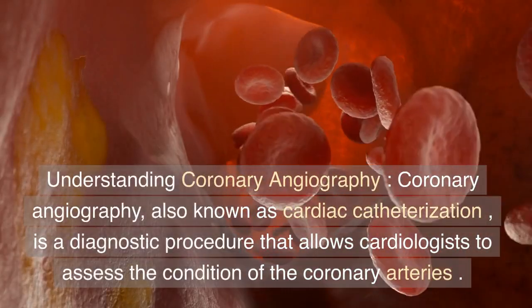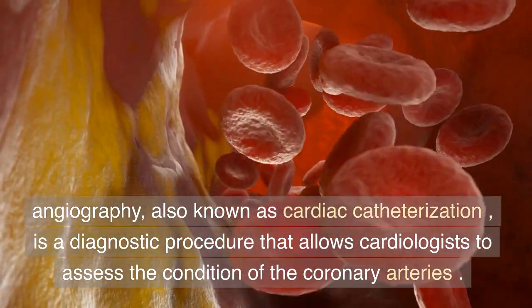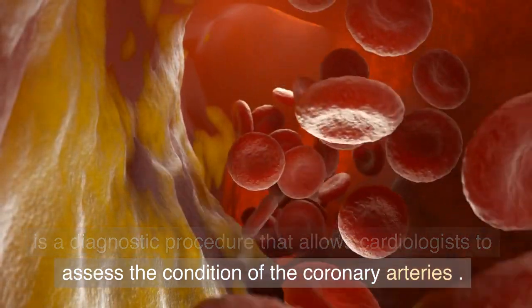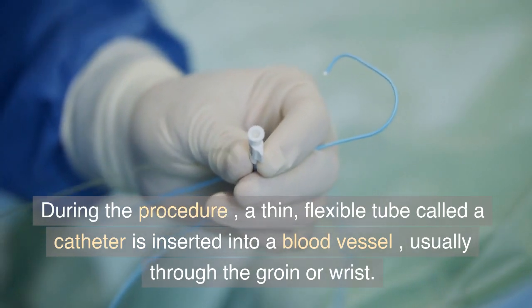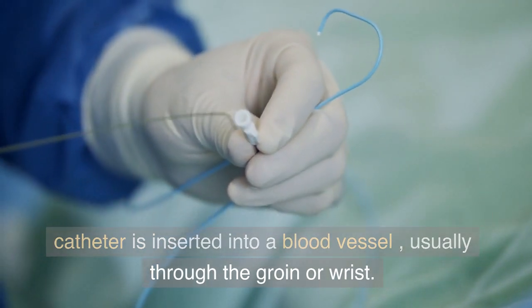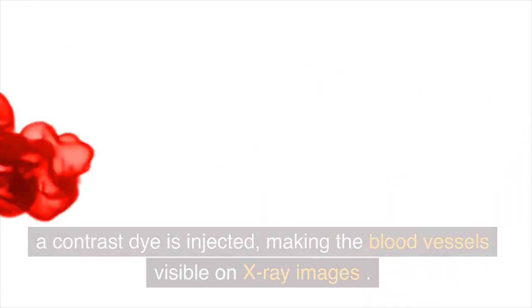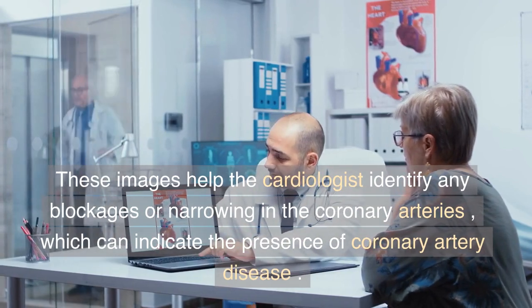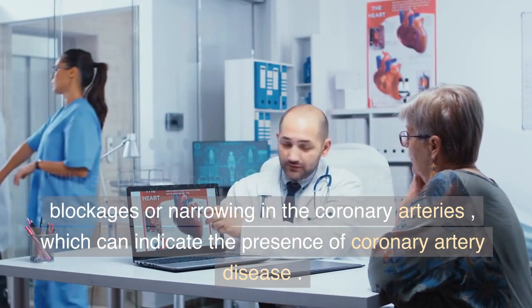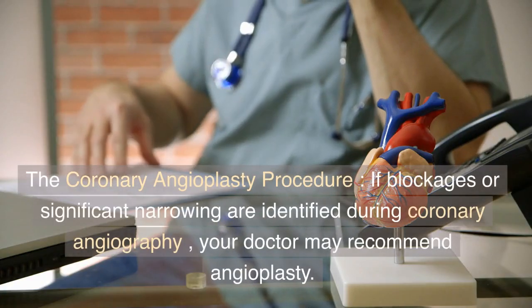Understanding coronary angiography. Coronary angiography, also known as cardiac catheterization, is a diagnostic procedure that allows cardiologists to assess the condition of the coronary arteries. During the procedure, a thin, flexible tube called a catheter is inserted into a blood vessel, usually through the groin or wrist. The catheter is then carefully guided to the heart and a contrast dye is injected, making the blood vessels visible on X-ray images. These images help the cardiologist identify any blockages or narrowing in the coronary arteries, which can indicate the presence of coronary artery disease.